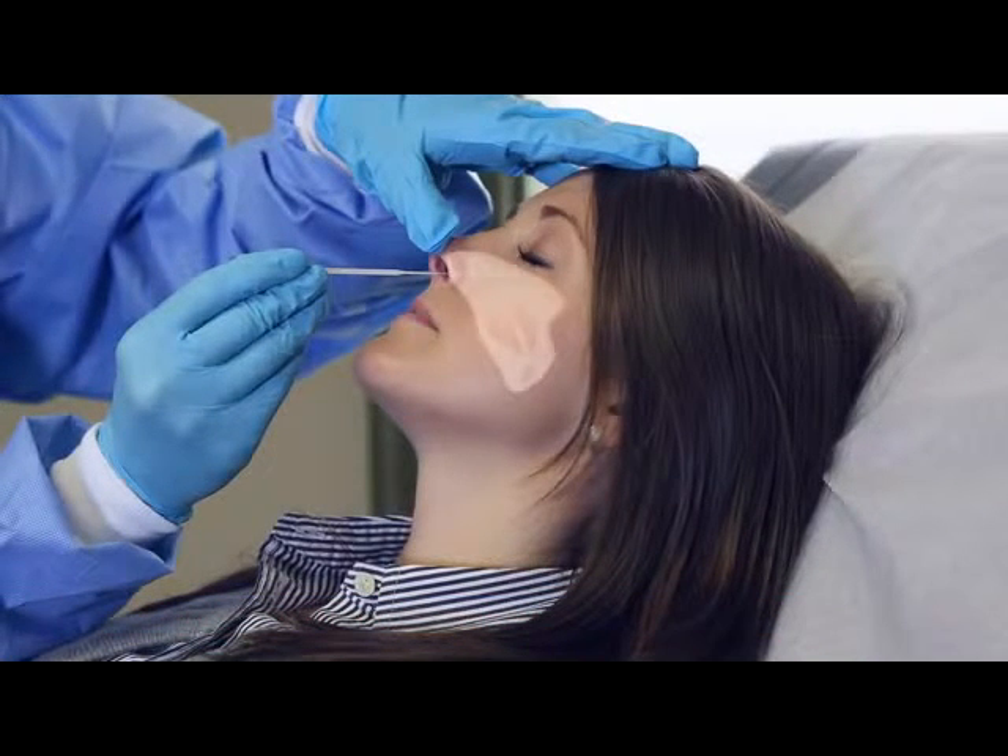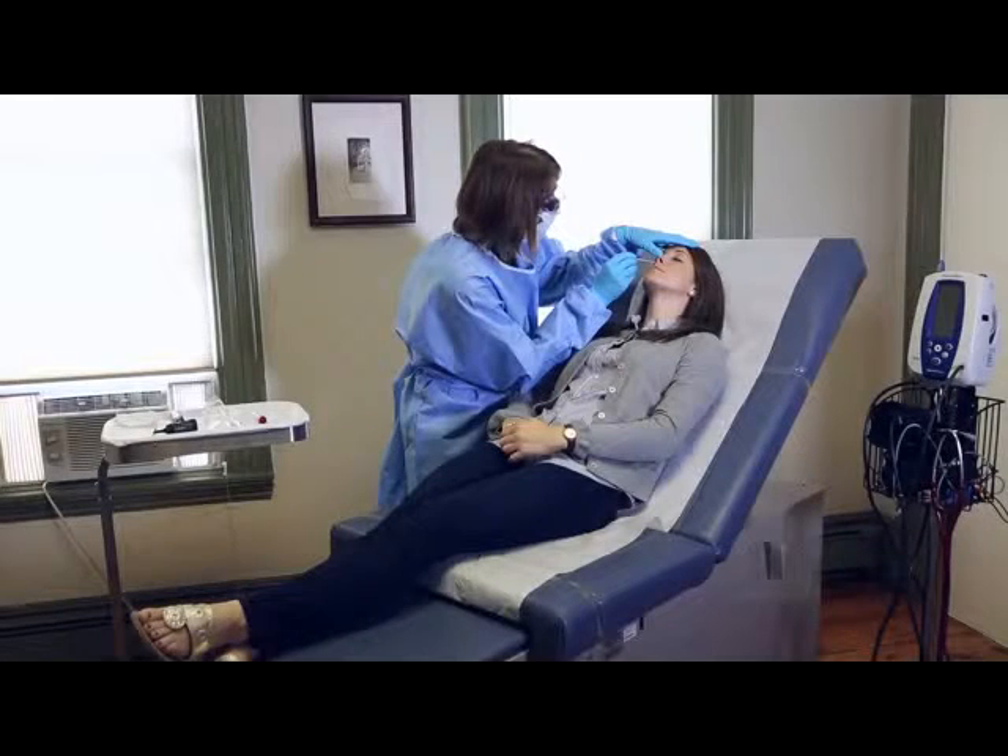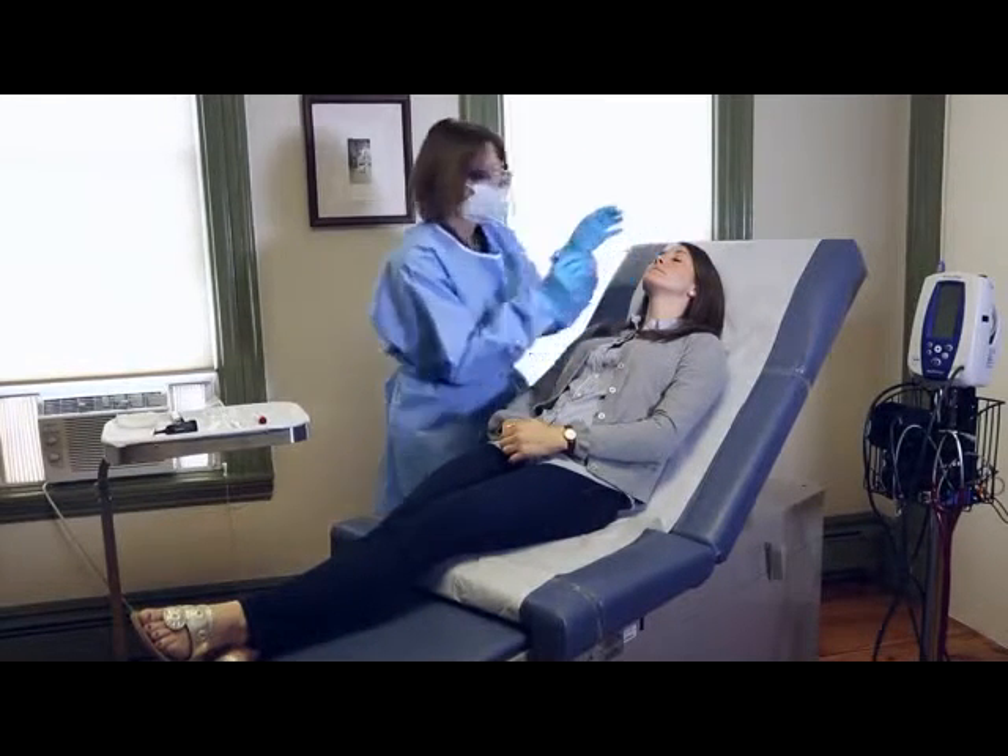The distance from the corner of the patient's nose to the front of the ear gives an estimate of the distance the swab should be inserted. Rotate the swab up to five times and hold the swab in place for five to ten seconds to collect sample material.